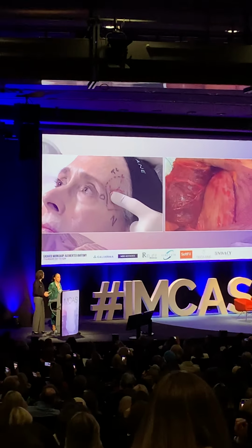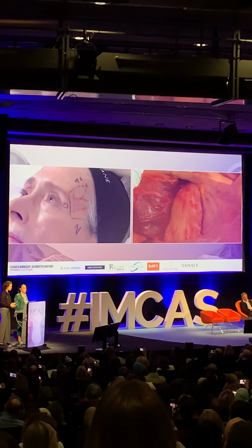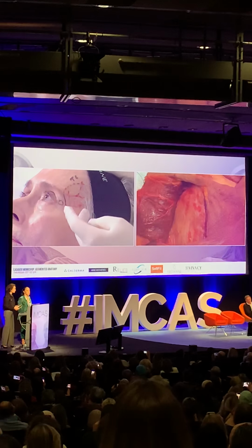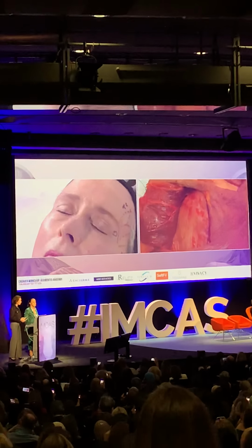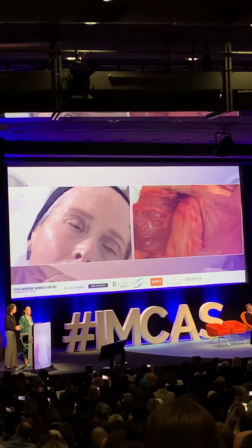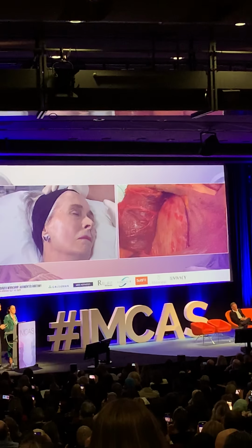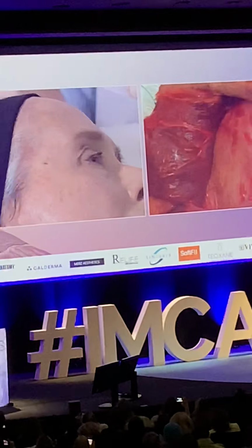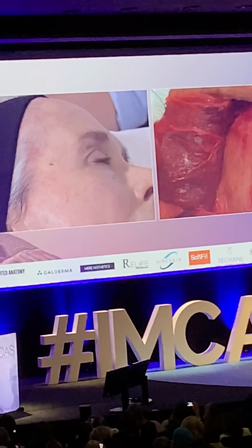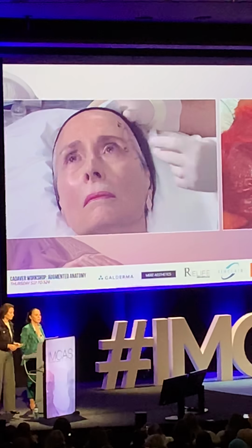So I will use a longer needle for this patient, and I will do it on the other side. So you will keep these anatomical drawings on this side, and I will go on the other side, and I will do my injection where I put the cross, and this point is the most concave point of this area. Do you have any question regarding this area, the temporal area?